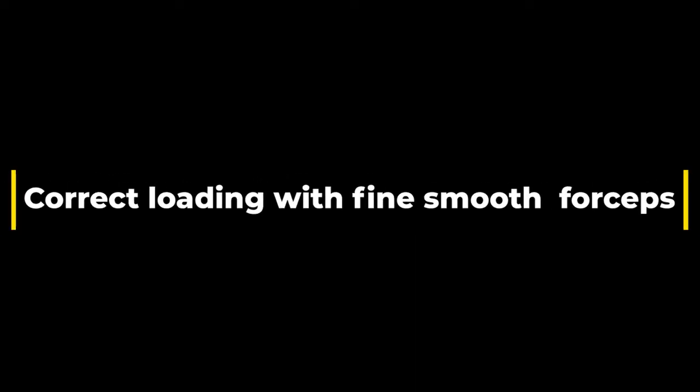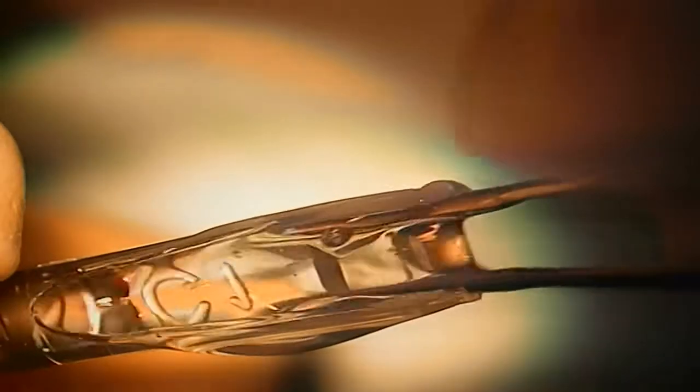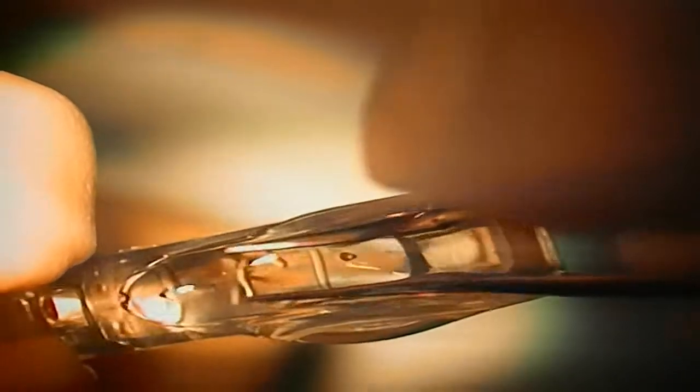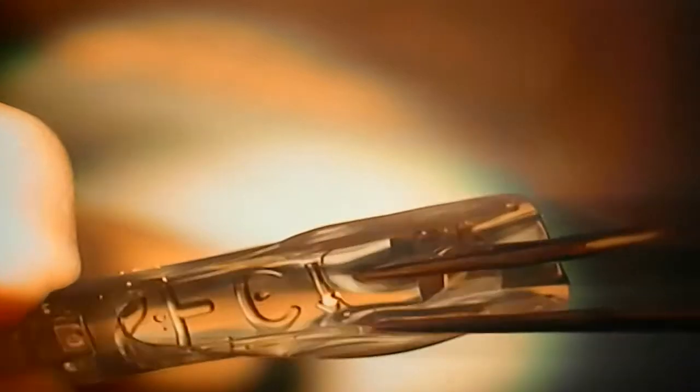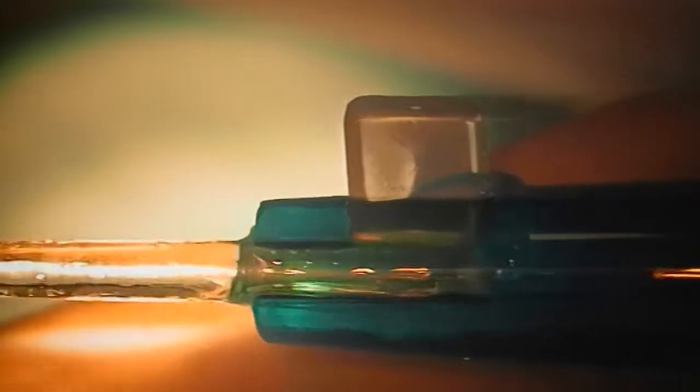So we can also use a much simpler technique with a very simple, smooth forceps like McPherson that we all have. We just fold the lens halfway, use a wet forceps and push it gradually with a half-open forceps, pushing the optic border and the lens will squeeze itself down into the conus.